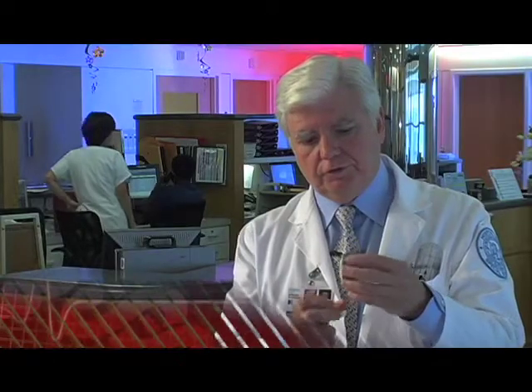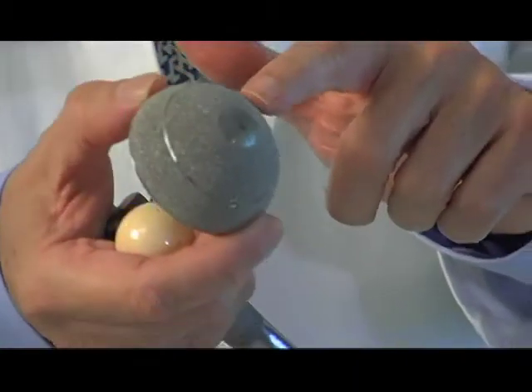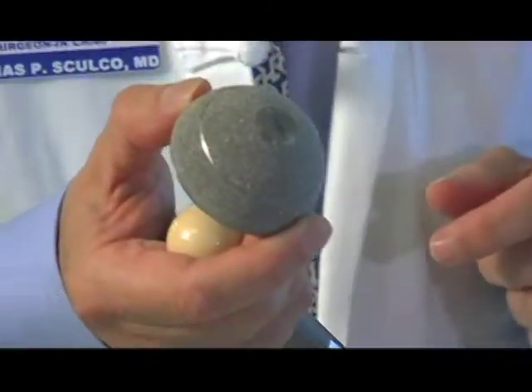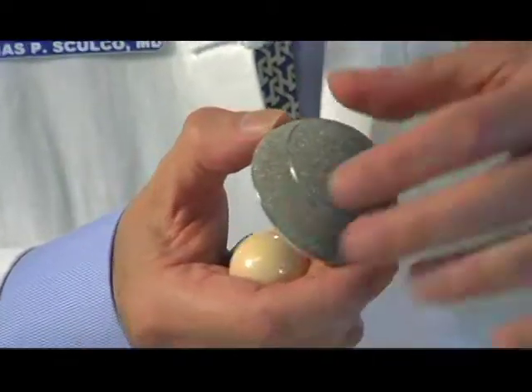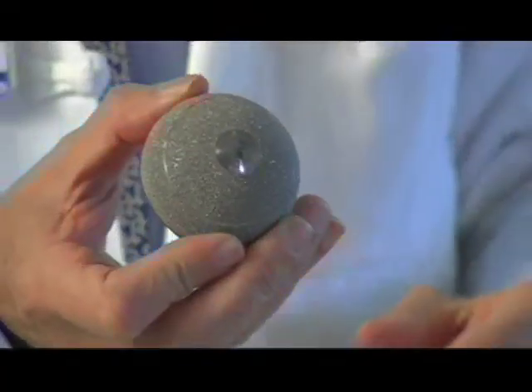This is the socket, and you can see that the back of this socket — this is also titanium — has all these little shiny areas, and these are beads. There are probably five million small beads on the back surface of that socket, and then the bone will grow in between all those beads.